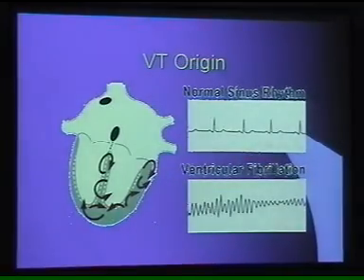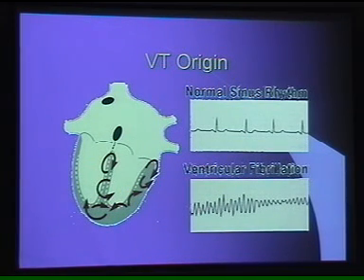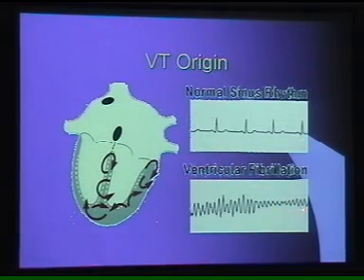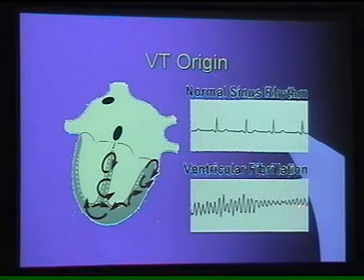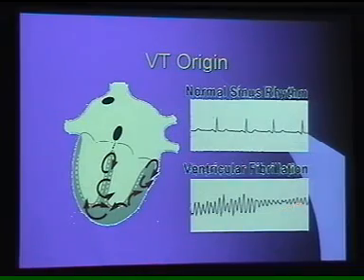Next one. The ventricular tachycardia originates in ectopic foci in the ventricle, and that is the shape of the ventricular tachycardia. Broad QRS complexes and irregular shape of the QRS, and eventually it degenerates into fibrillation, where the irregularity becomes more marked. Contrast that with the normal sinus rhythm. That's the normal rhythm, and that is the tachycardia and the fibrillation. Next one.